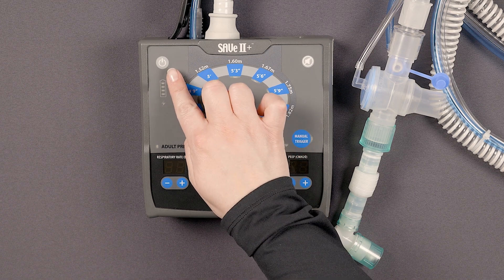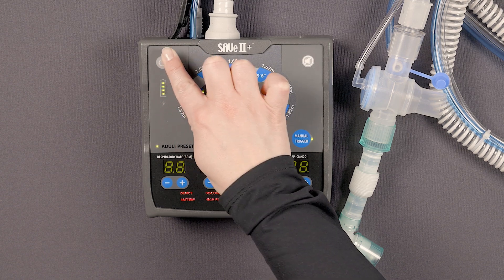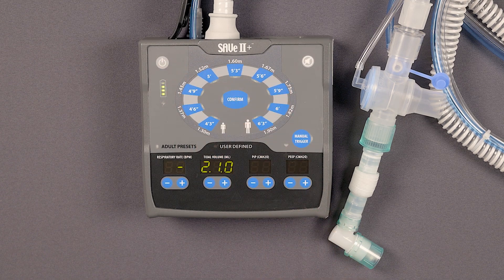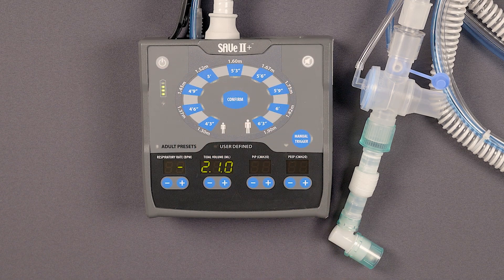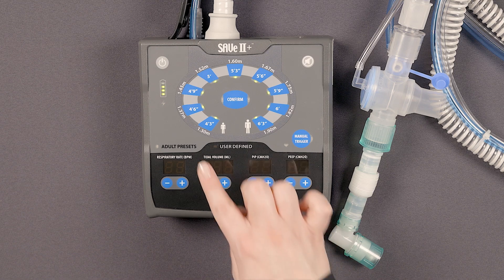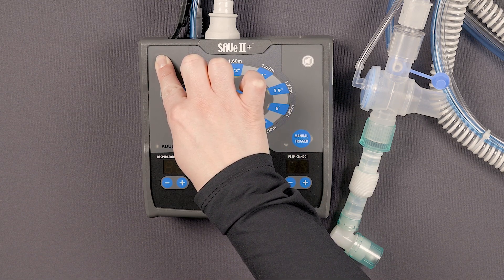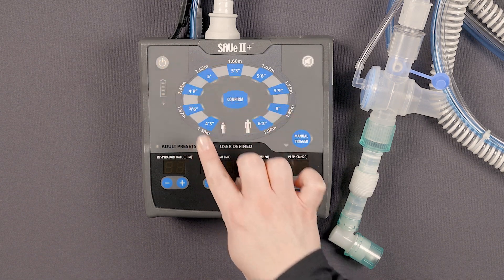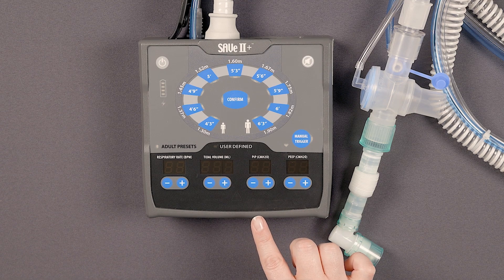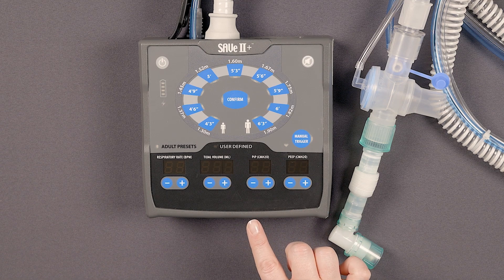This is the power button used to turn the device on and off. Press this button for one second to turn on the ventilator, or hold it for three seconds to turn the ventilator off and shut it down. An audible alarm will activate one second prior to the ventilator shutting down.